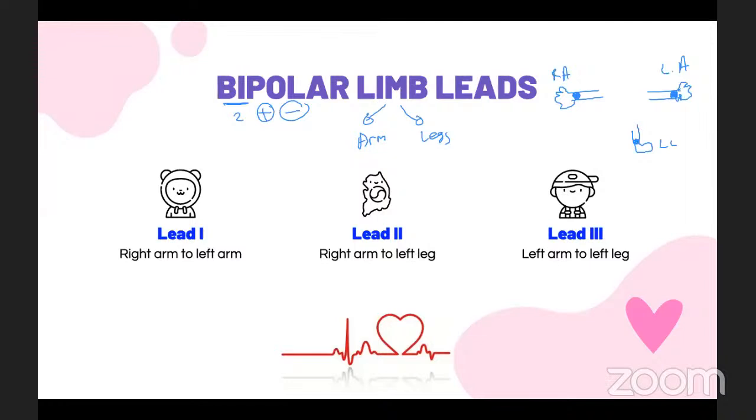But before we do the triangle, I'm going to ask you guys a question. Now, they're going to be positive and negative. Remember how we said 2 poles, bipolar. So we're going to use positive and negative charge with the leads. We're going to make them positive and negative. What will that do to the human body if there are positive charges and negative charges? Can you give me guesses? Any guesses in the chat box? It's fine. It's a hard question.